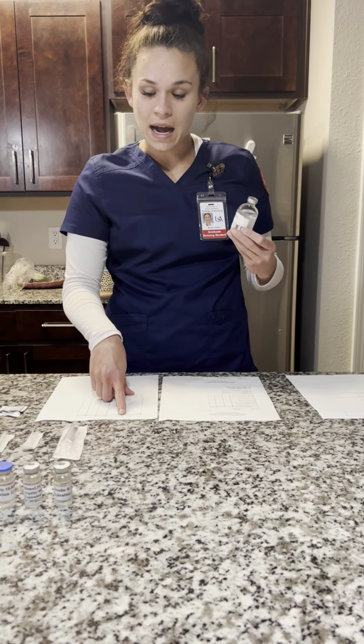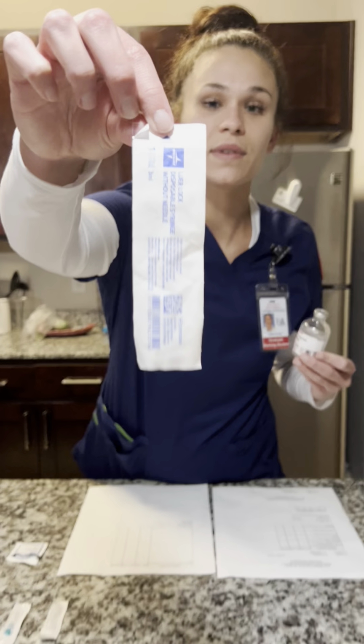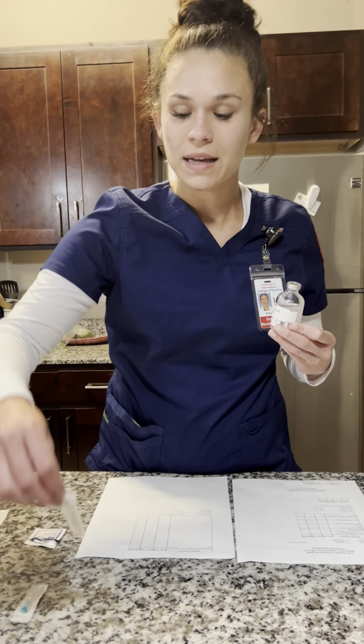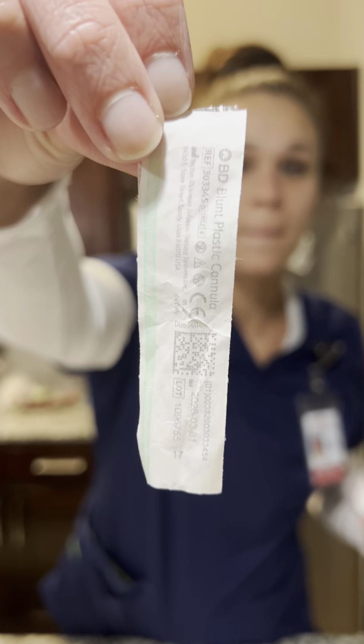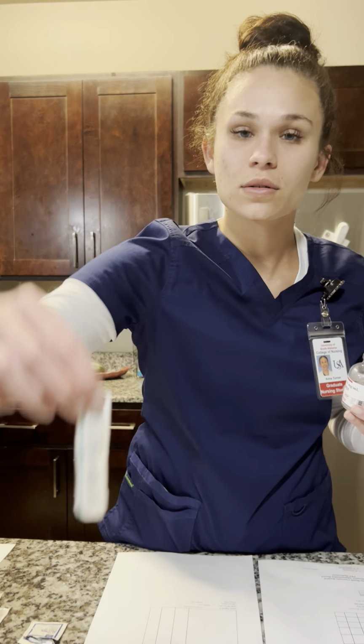The route, which is IM, so for IM, I'm going to select a 3 milliliter syringe, a plastic blunt cannula, and a 23 gauge needle.